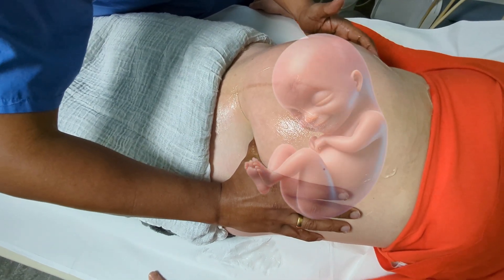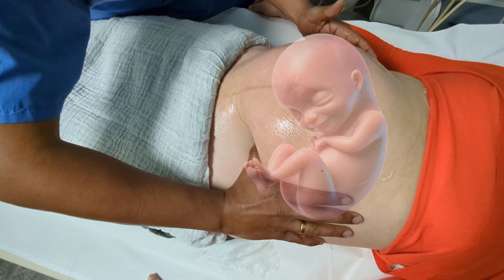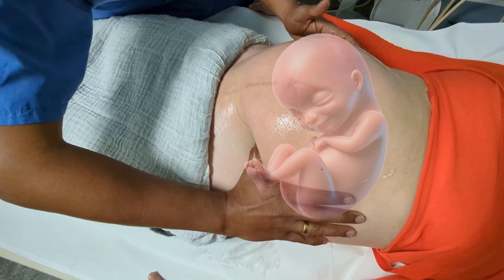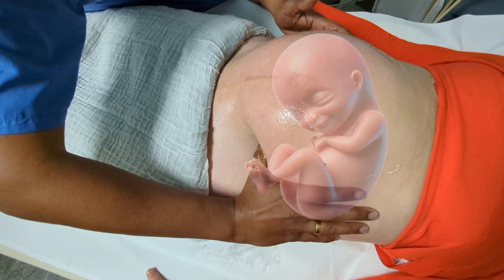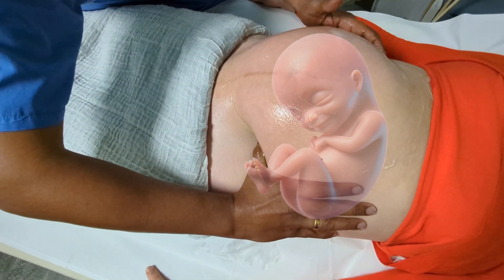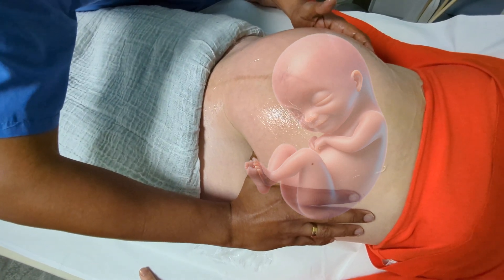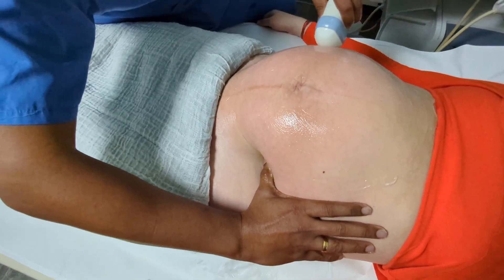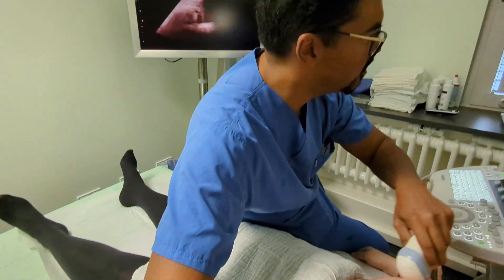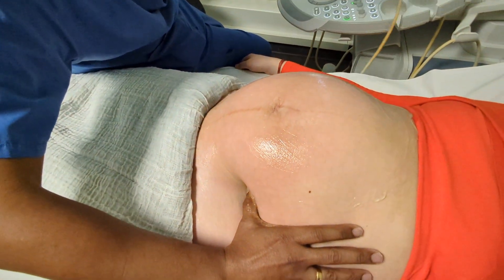Sometimes you can even see the movements across the abdomen. I'm going to ask the mother to help. The baby is now in a transverse position — you can confirm that with the ultrasound.